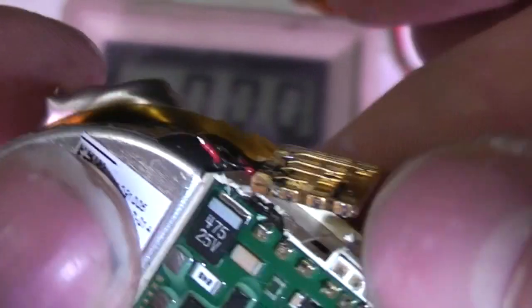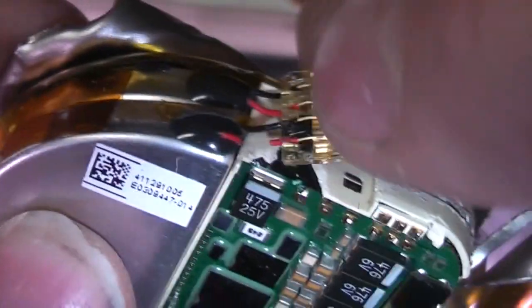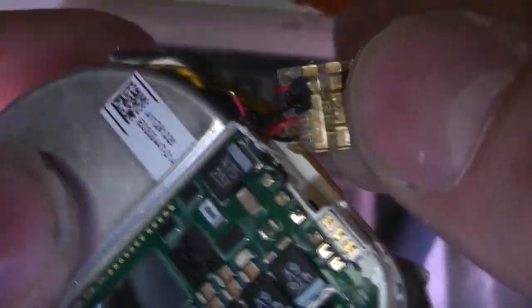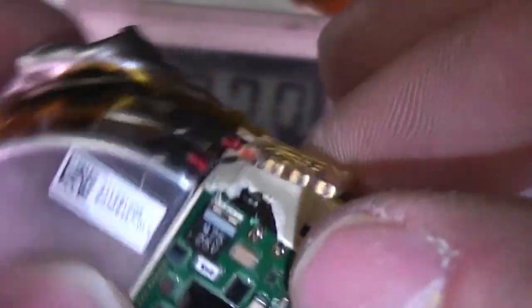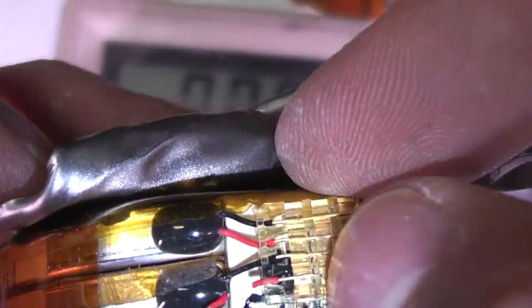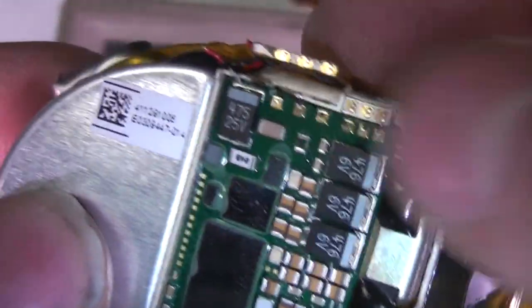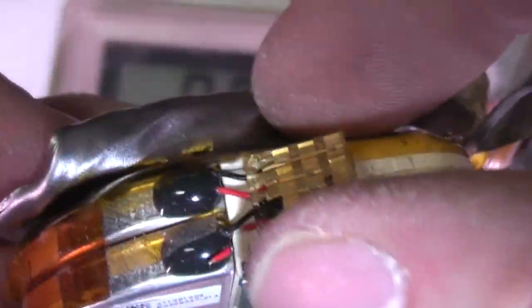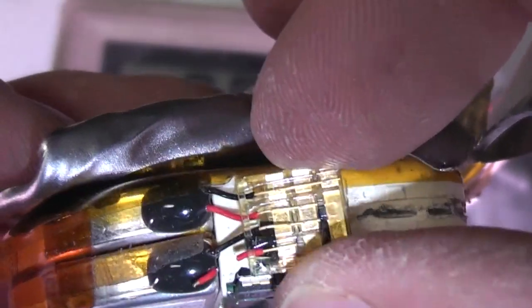This is just a piece of moulded plastic. Seems a quite convoluted way of just getting these wires around the corner, but obviously it's a very compact unit. The other thing to notice is that almost all these connections are welded rather than soldered. Obviously that's for reliability. Probably they may well be machine robot welded as well.